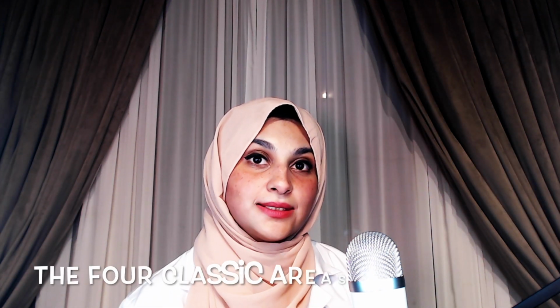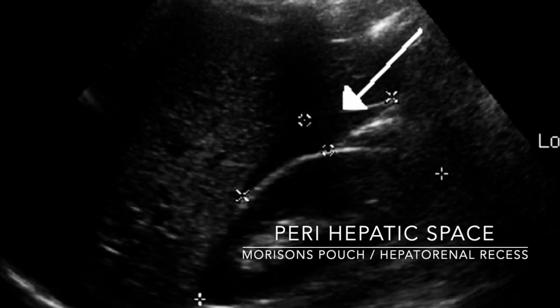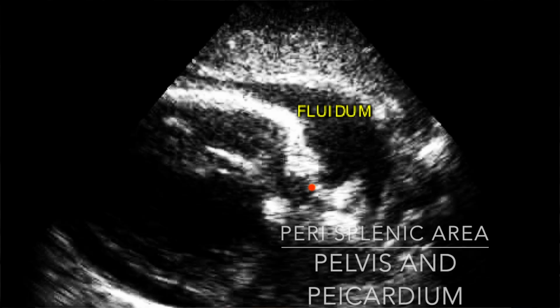The four classic areas that are examined for free fluid are the perihepatic space, also called Morison's pouch or the hepatorenal recess, the perisplenic area, the pelvis, and the pericardium. With this technique, it is possible to find any intraperitoneal or pericardial free fluid, which is usually due to trauma.